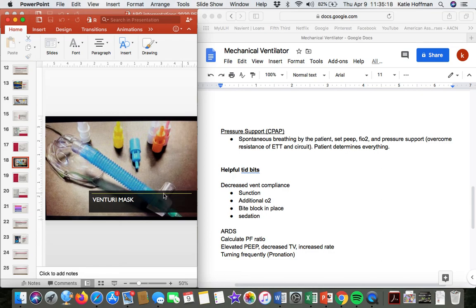So you'll pop this little plastic piece off, and you'll pick either this blue or white piece. They've got a bunch of different options here, but we have a blue one and a white one at U of L. And then we have this other little white adapter piece. Basically the blue portion has lower levels of oxygen on it. The white piece has higher levels of oxygen on it, meaning, for example, 8 liters of oxygen at 45%. Depending on the oxygen settings that your patient is actually on is the piece you'll choose. So find the one that most closely matches what your patient is on.